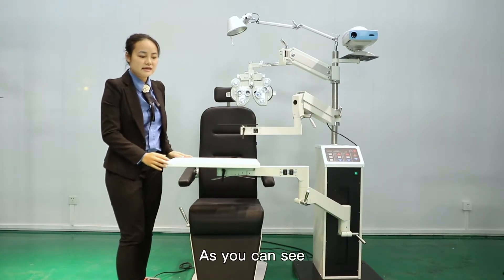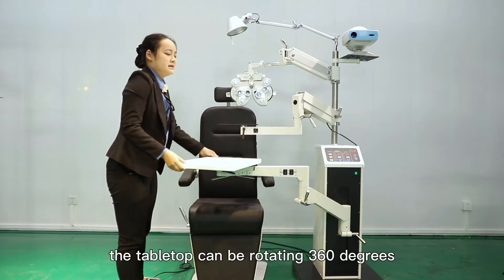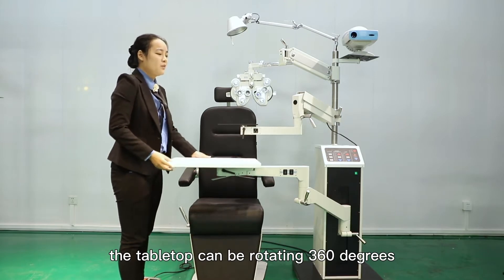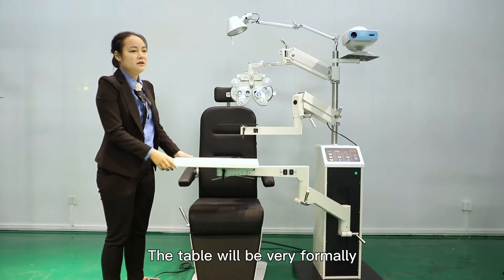As you can see, here is a lock under the tabletop. We loosen it. The tabletop can be rotated 360 degrees — very flexible. We lock it up again, and the table will be very firm.